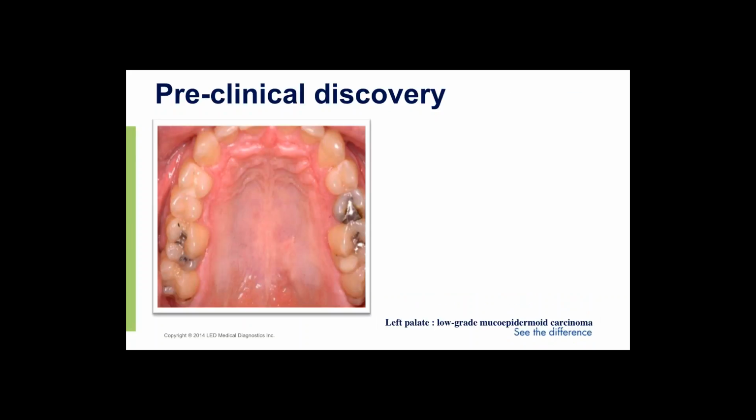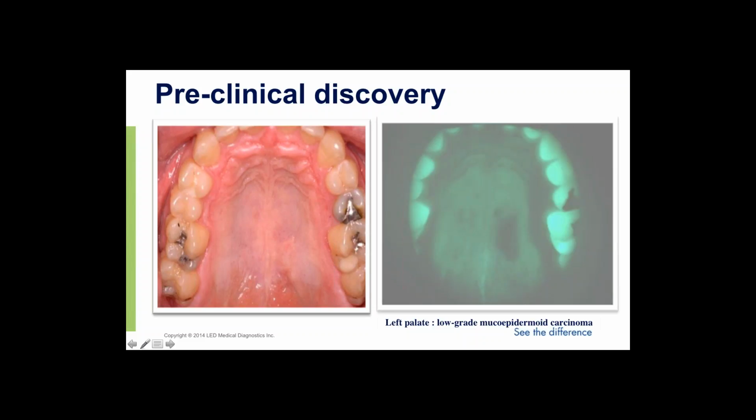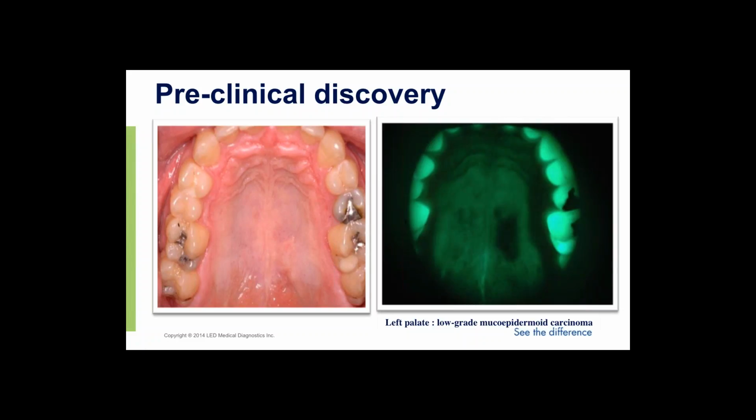So last picture, there's definitely something here. I want you to look at this palate and think about where there might be something of concern. So be honest with yourselves. Who guessed that area? Now, for those that guessed, yeah, I saw that sort of area. My question to you is, if you saw that, what's more apparent, to the left or the right? What are you not going to miss?